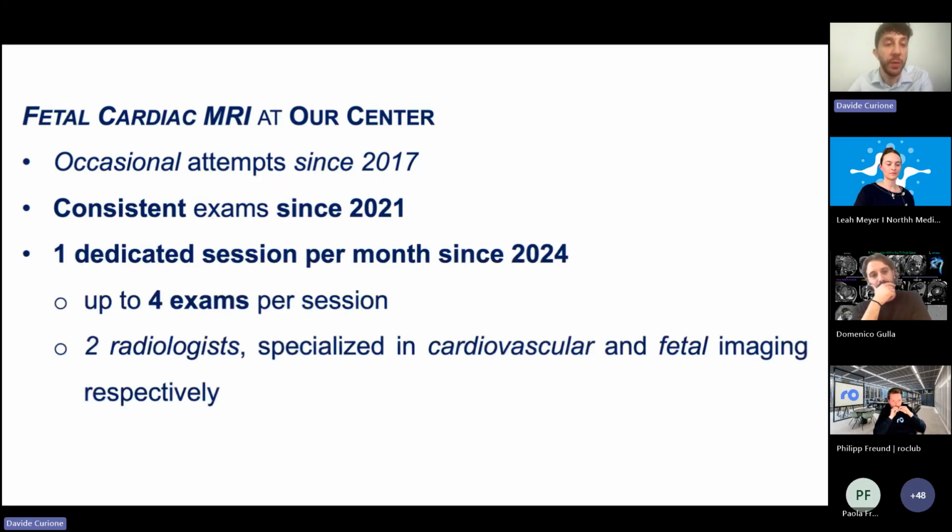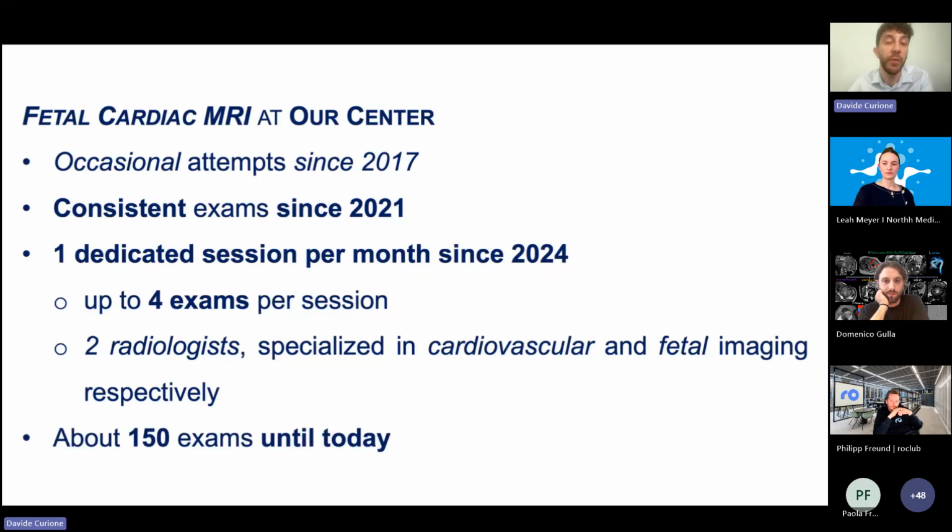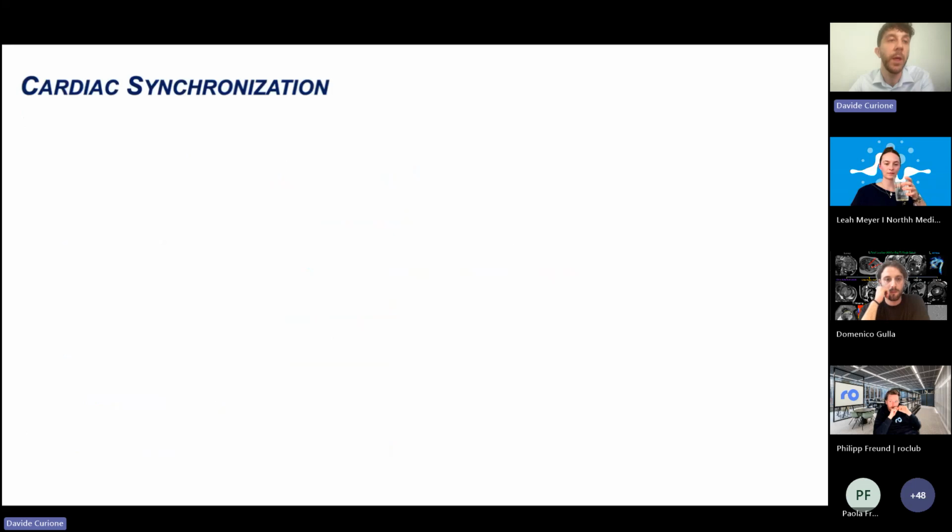And since 2024, we've had one dedicated session per month, performing up to 4 exams per session, with the collaboration of 2 radiologists, one specialized in cardiovascular and one in fetal imaging. To date, we've performed about 150 exams, which is still a relatively low volume, but it's helped us build a reproducible workflow and gain some confidence in the technique.